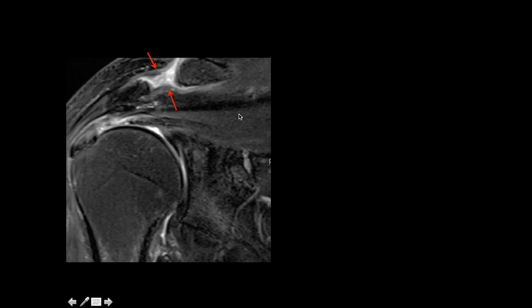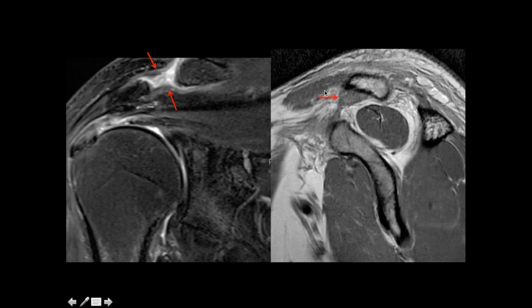In the second case, the AC ligaments are injured, but the CC ligament is intact — though you cannot identify the internal fiber architecture, indicating it is sprained. Since the CC ligament is not torn, this is Type 2 injury.